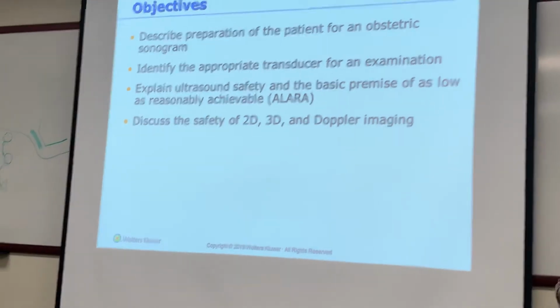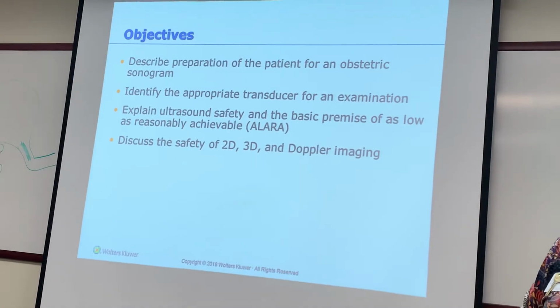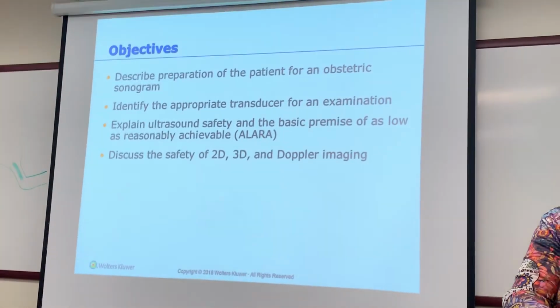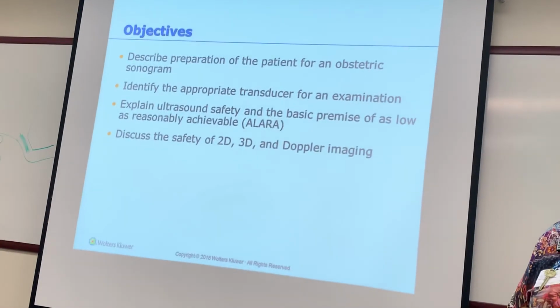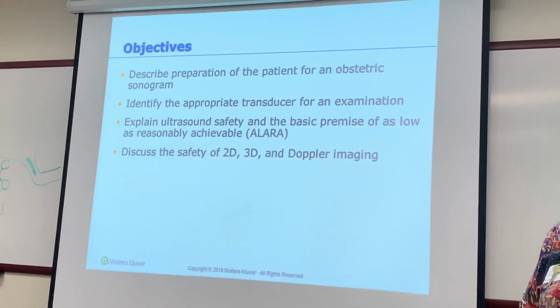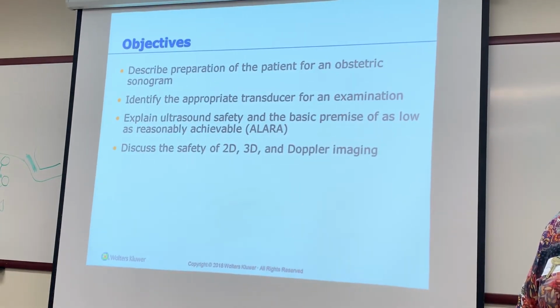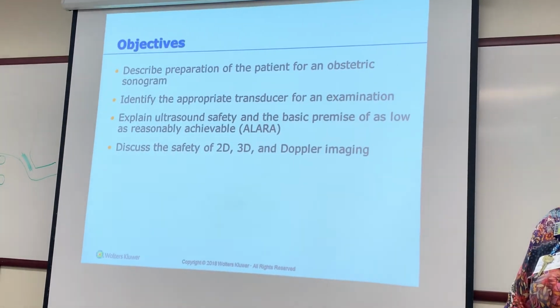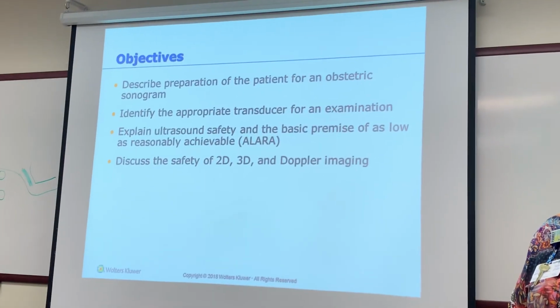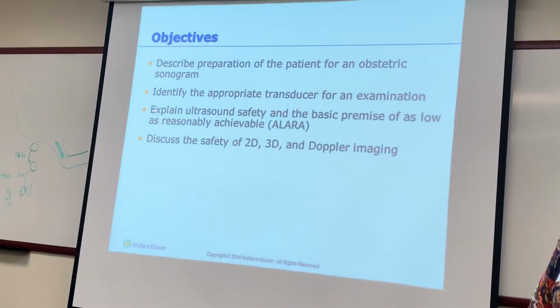That's why in ultrasound we have a 2-week error that we can make, because we go by what the patient says. Now, in the first trimester, we're allowed a 10-day error. The ultrasound is more definitive than what the patient says. Like, my LMP says that I'm only 4 weeks, but the ultrasound says that we're 6 weeks. We're gonna go by the 6 weeks.